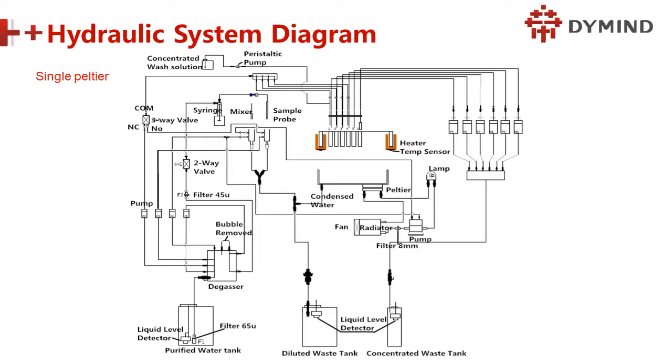So next, this is the clean system for this and the clean system for the cuvette, and also we have a cooling system, right? Why do we need a cooling system? Because the lamp gets hot, and if the lamp is hot, the calculating system will not work properly. So we must have a cooling system for the lamp, to make it stable, and then the performance will be very stable. So you can see the pump here is pumping the water here, and from here it's cycling. Okay.